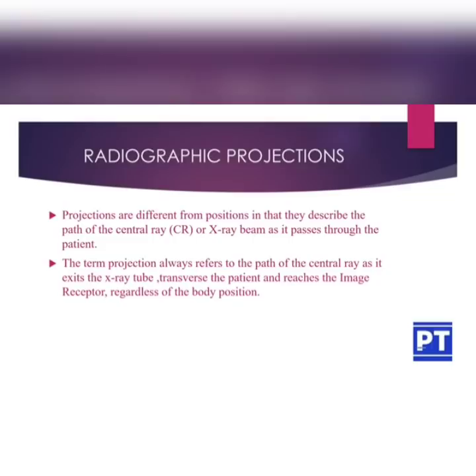Radiographic projections. Projections are different from positions in that they describe the path of the central beam, CR or X-ray beam, as it passes through the patient. The term projection always refers to the path of the central ray as it exits the X-ray tube, traverses the patient and reaches the image receptor, regardless of the body position.